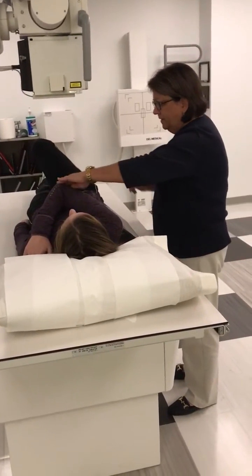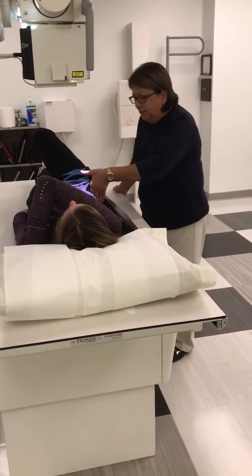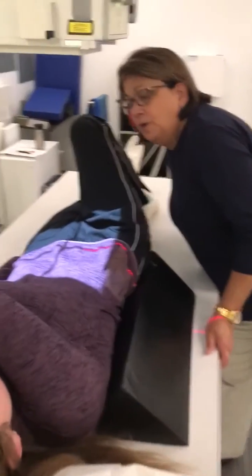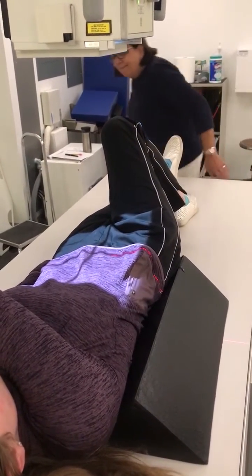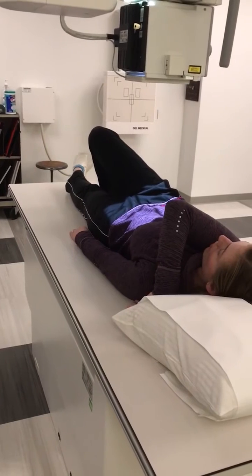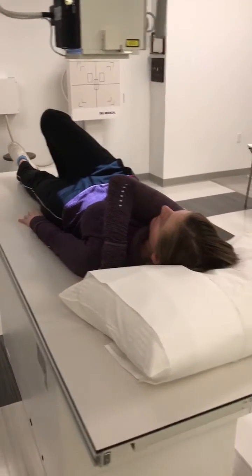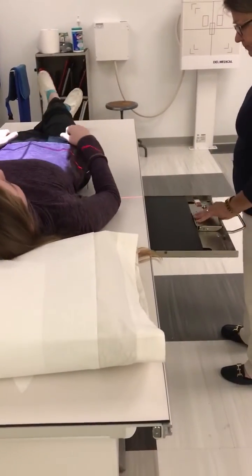Okay. Bring that right arm up. Again, centering at the level of the crest and the vertebral column. Taking a deep breath, blow it all the way out, and hold it, exposure. You may breathe and relax. Take the sponge from behind you, just lie flat.